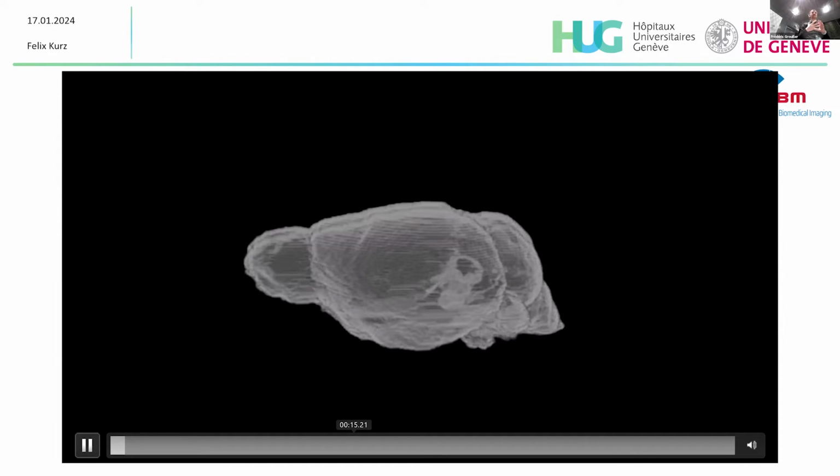give us an image signature. And of course, when we have all the other correlative maps, we can quantify this image signature. And we know where the tumor cells are, so we have a direct correlate. This is what's interesting for us. Oh, sorry, the program crashed. Then I restart.